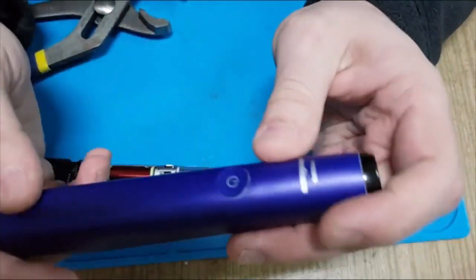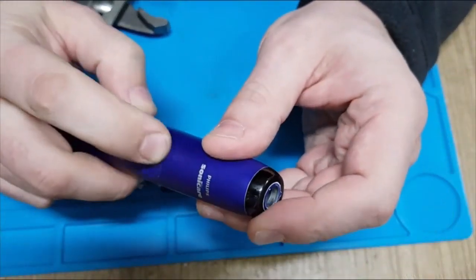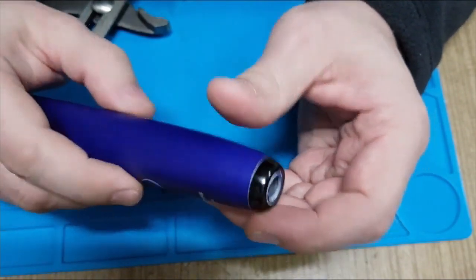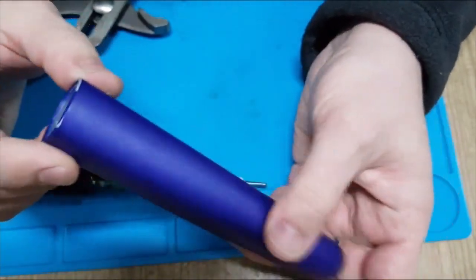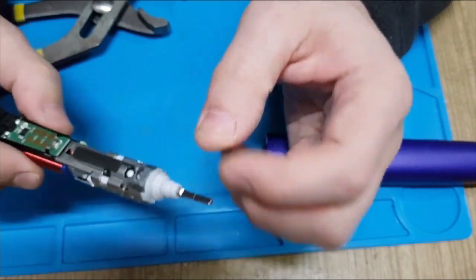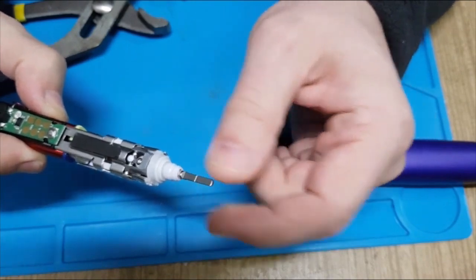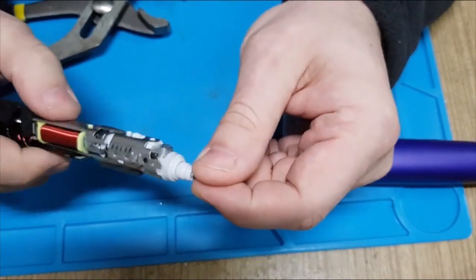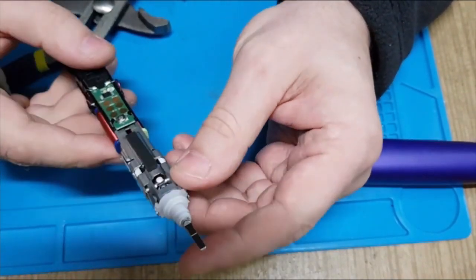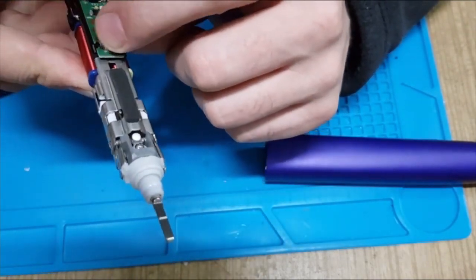Yeah, one more thing. Some more defects that come to these toothbrushes are sometimes even simpler. Some toothpaste builds up in this button. So you just need to wash it out, and it will function. Sometimes you have a mechanically damaged or broken pin, and you have a quite loose shaft, and then you don't have many options to repair it. You need some spare parts or another toothbrush to replace this part.